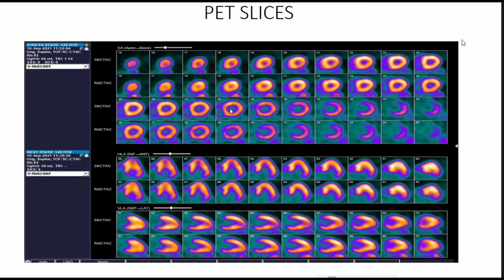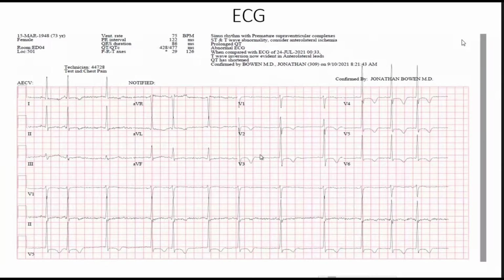Steve, I guess the question would be, if you looked in the context of echo and you looked at these slices and you pretended for a second that it was an echo, particularly on the vertical long axis, that might give some clues too, I think. I guess the other point was the EKG did not look convincingly sinus rhythm on the prior strip. Maybe you saw a couple of P waves, but there was a lot of irregularity and no convincing, consistent P waves that I could see, at least. Good point.